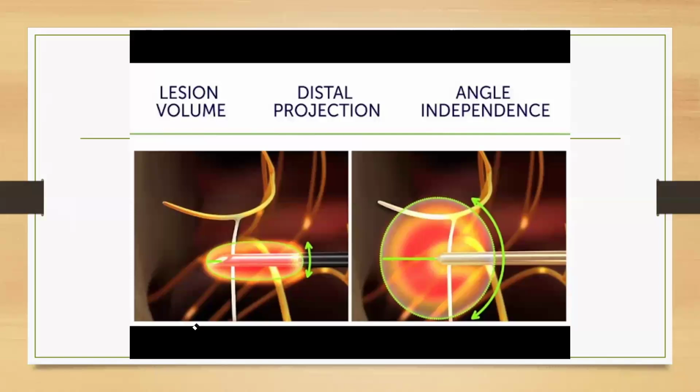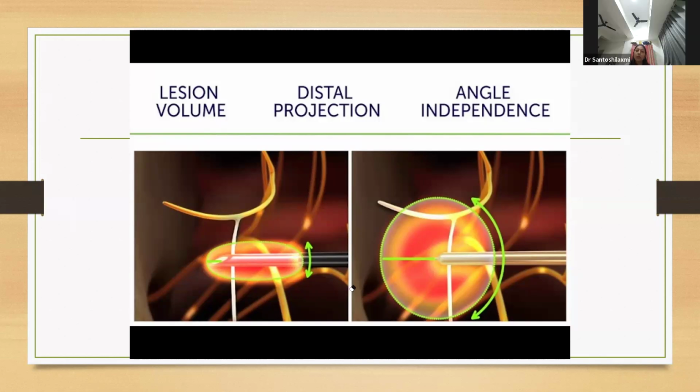Yes, sir. Now, one more question. What about pulse radiofrequency? The needle tip should be perpendicular to the target. In pulse radiofrequency, the lesion temperature is beyond the tip. So your needle tip should be perpendicular. Is this clear? Yes, sir.